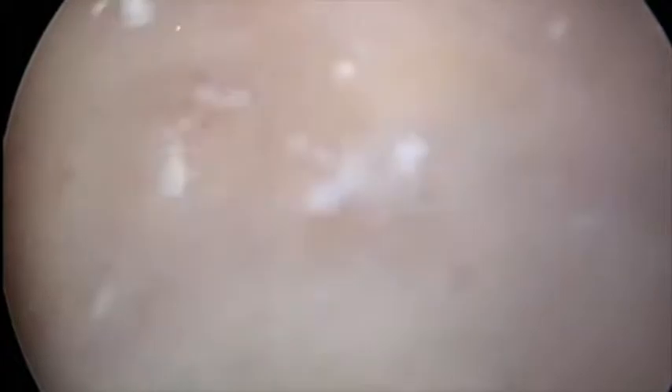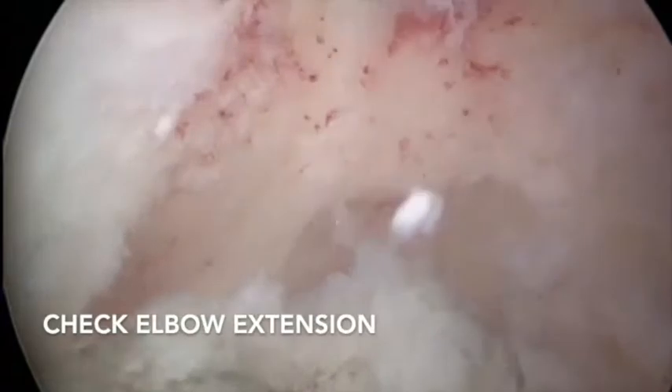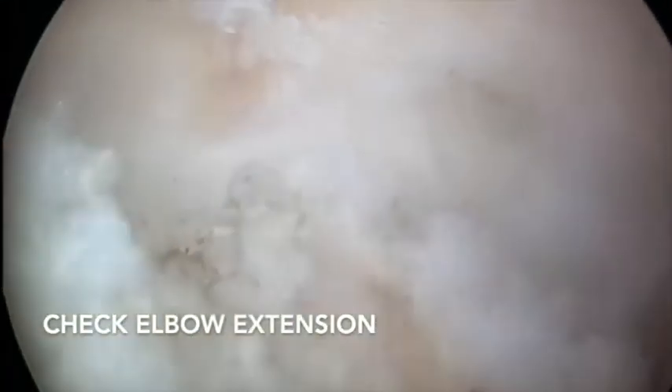It's very important that during surgery we continuously check how we are gaining mobility of the elbow — flexing and extending it. This intraoperative mobility test, together with the preoperative CT scan, indicates how much bone and how many osteophytes we need to resect, checking if full extension is being restored.